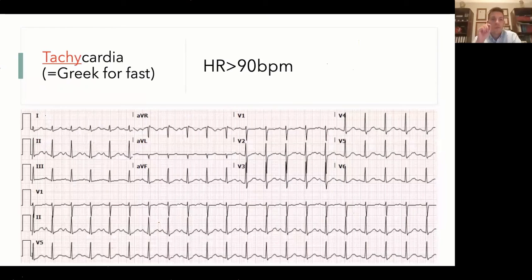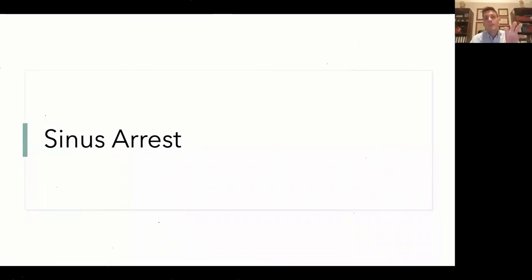Now, this is a rather difficult ECG strip. Why? Because you can see the P wave here and here and here and here and here and so on and so forth. We will stick here to lead 2. Can someone tell me what is the heart rate in this ECG? Yes, this is approximate and this is correct. It's 150. Why? Two big boxes, and this is a sinus rhythm. It's regular. So we use the rule of 300 divided by 2. That's 150. Excellent.